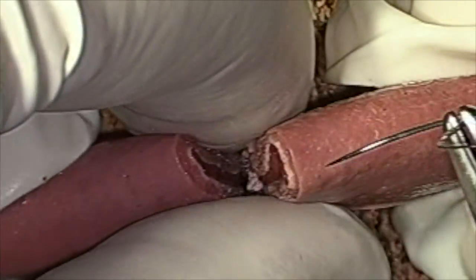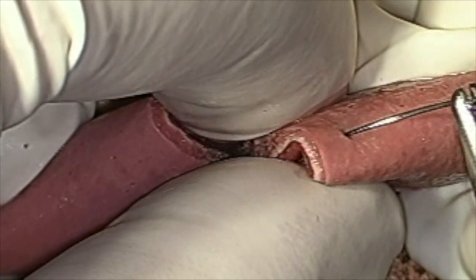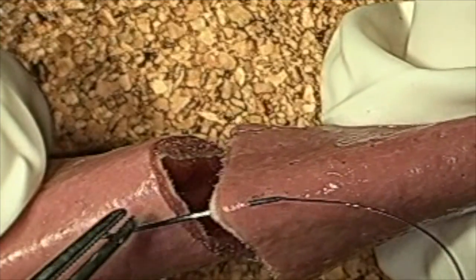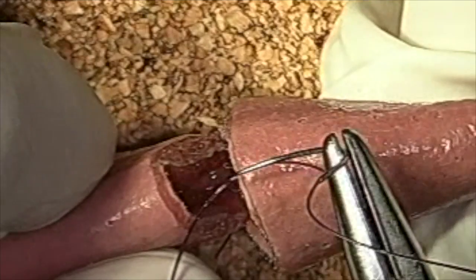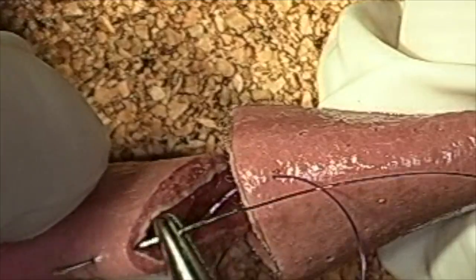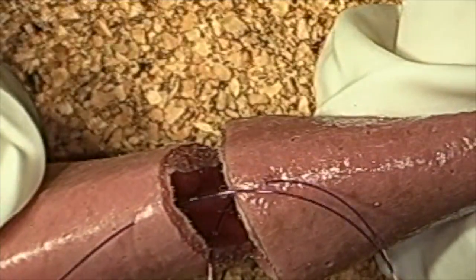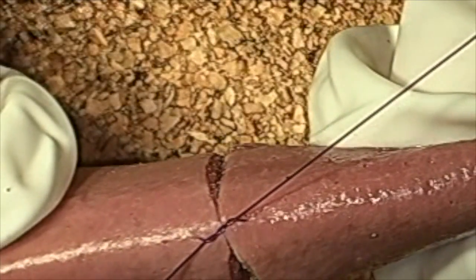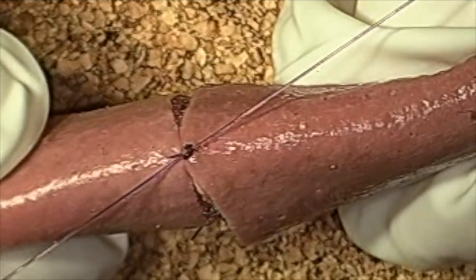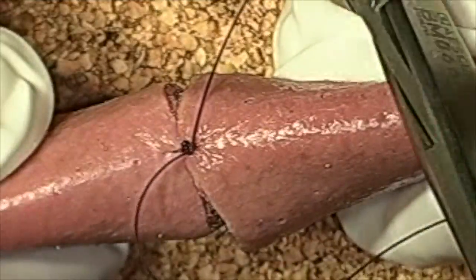We like to make sure that we have this kind of apposition. I'm using my fingers, which is totally fine as long as you're reducing contamination — your fingers are an excellent tool to use. I'm going to pass it to my forcep and then my assistant's holding the bowel. I want to make sure that I'm getting that bite just underneath the submucosa. Look how far I am from the cut edge — it's a safe distance that allows us to gather enough tissue to oppose the edges together of the resection anastomosis, as well as not have it ripped through.